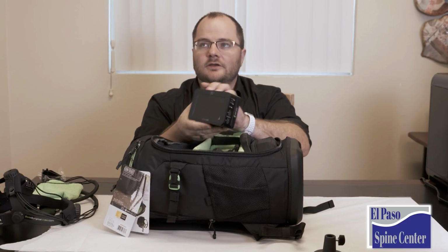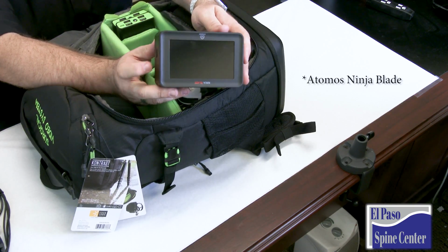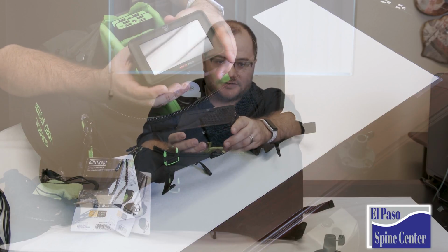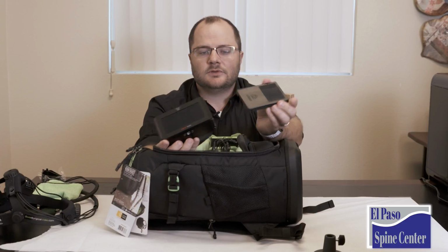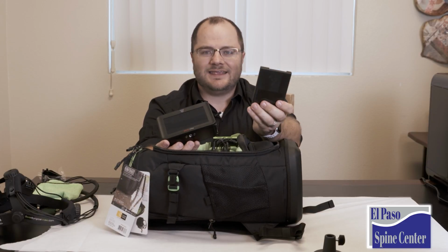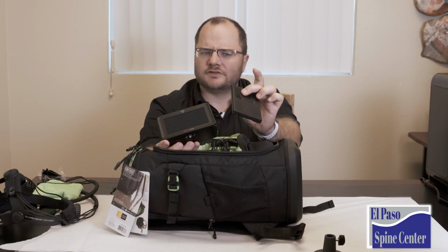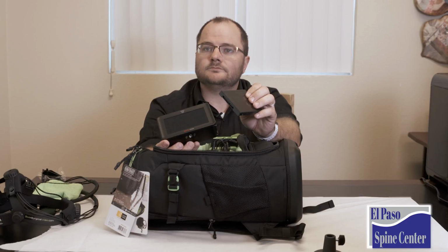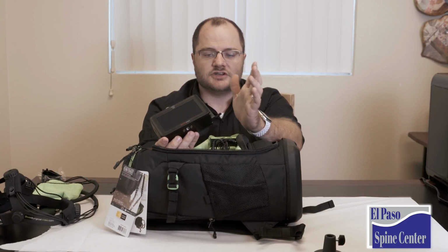There is an Atomos Ninja Assassin. This is a great recorder. This is going to be used in the wireless system to help record our setups. If you haven't used these before, they're really easy to use. Inside of the Atomos system, there is a 480 gigabyte SSD, or actually, I think it might be a hard drive. But this is what we're going to be using to record our wireless system onto the Atomos Ninja.